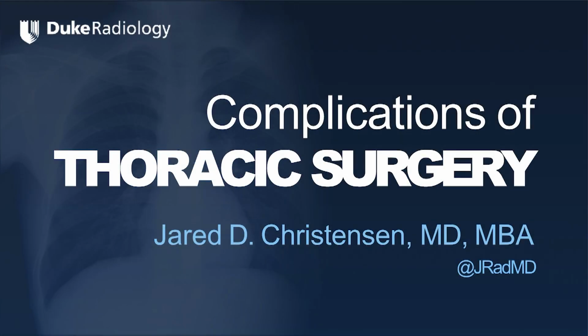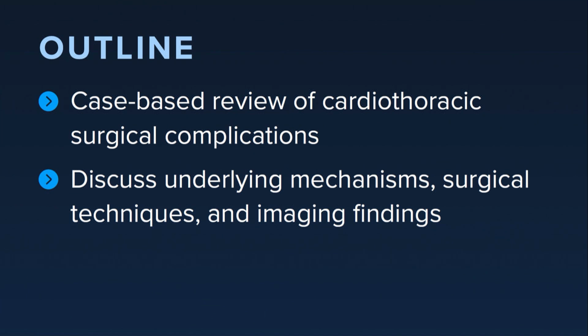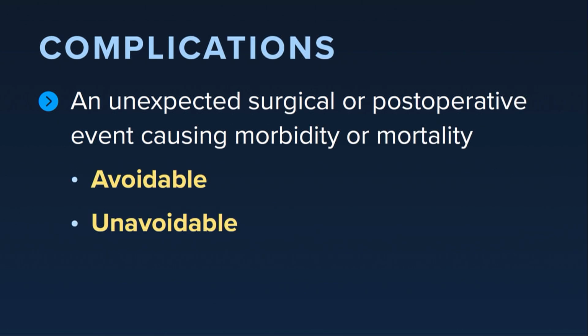So we're going to focus on a case-based approach to cardiothoracic surgical complications. And a lot of that is going to rely upon not just the imaging findings, but really an understanding of the surgical procedures and some of the techniques involved.